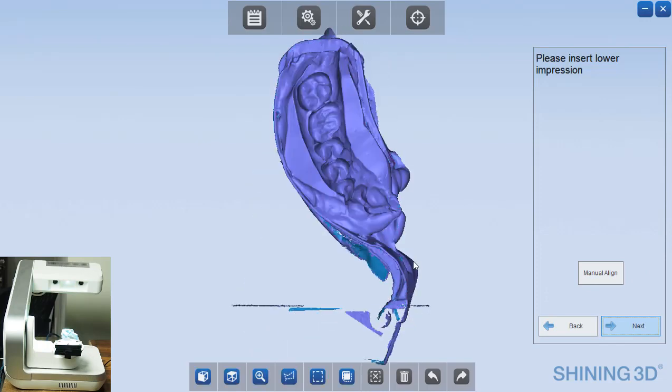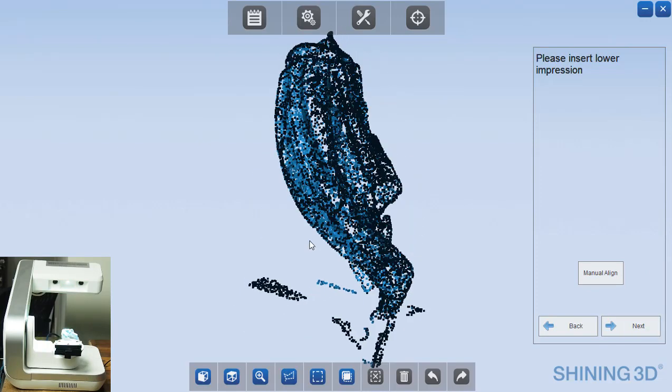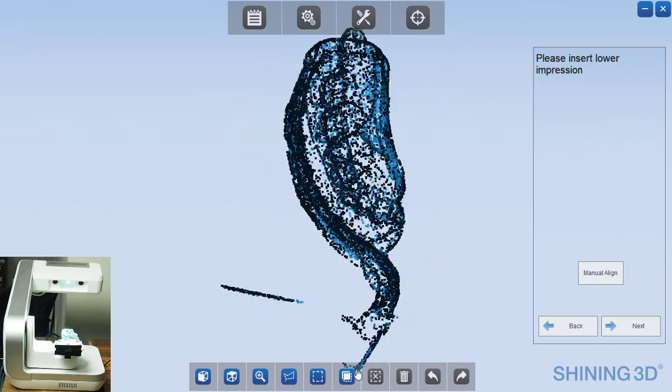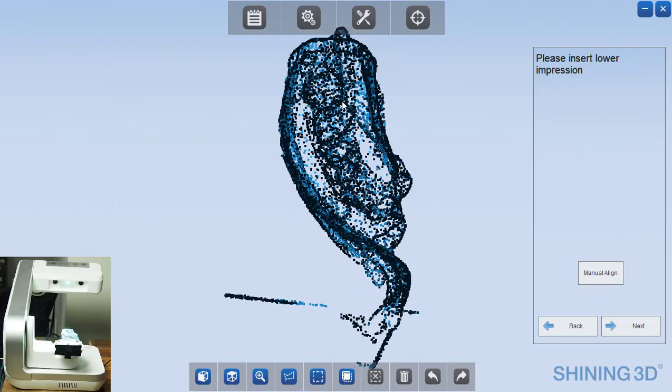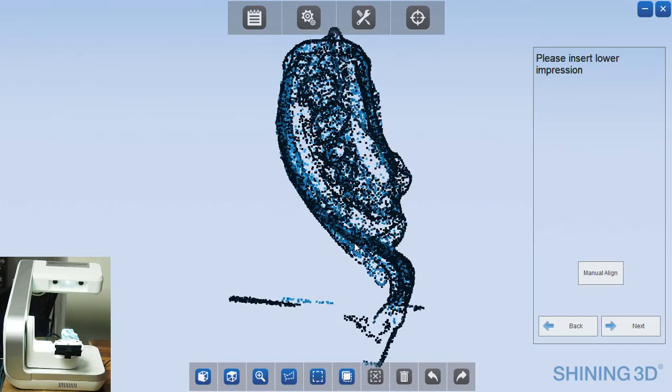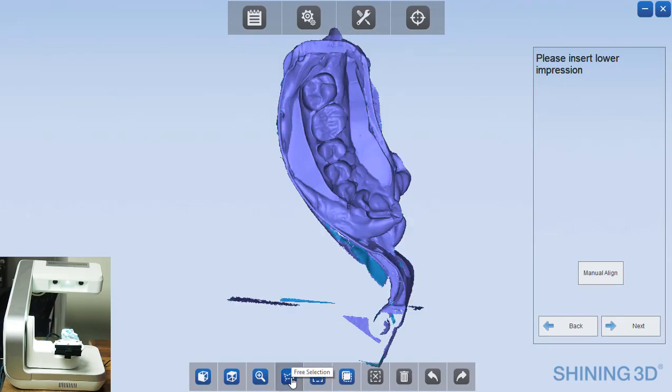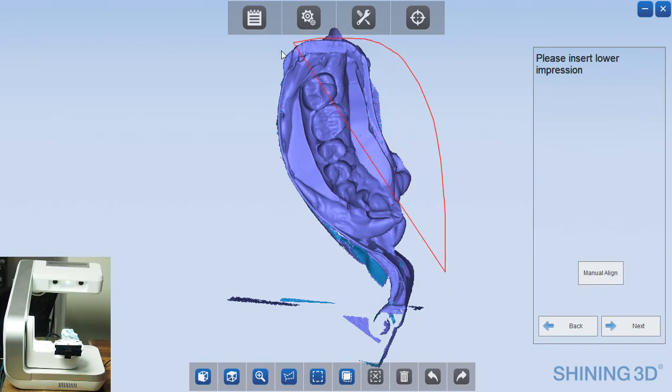And the next thing that will come up is the screen where the software stitches these together. It stitches those based on the external data of the scan. And you can see here that things have been meshed together properly.